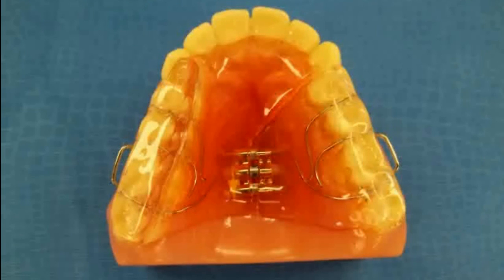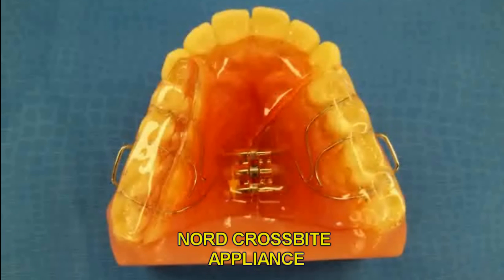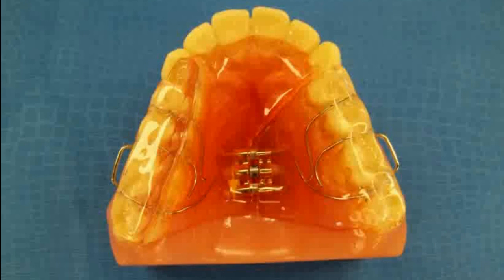The Nord crossbite appliance is very helpful to correct true unilateral crossbites. It's important to determine the type of crossbite before you select the appliance you're going to use. Long-term retention is needed with these types of cases.